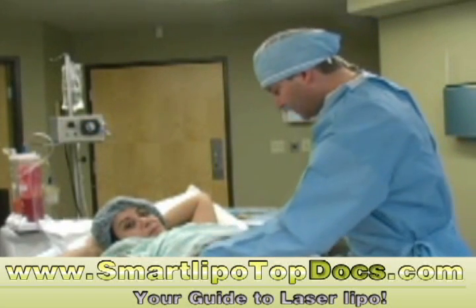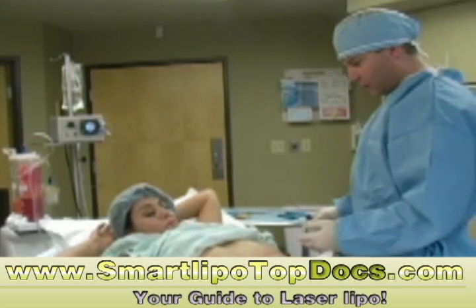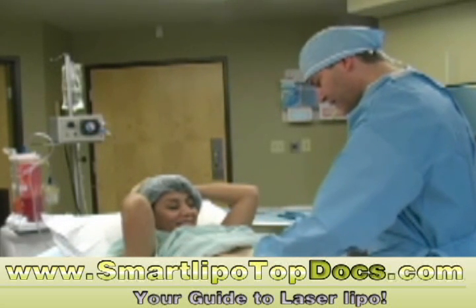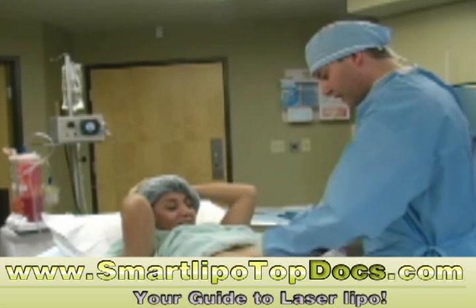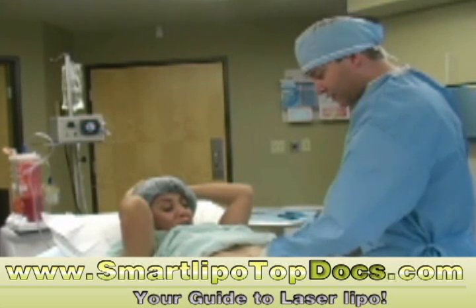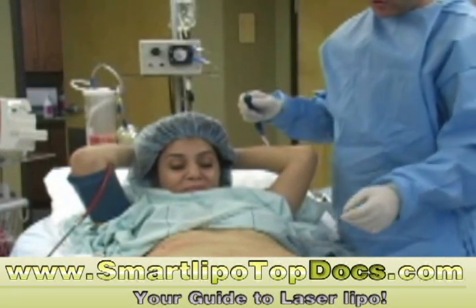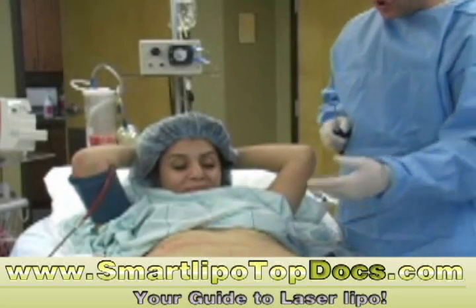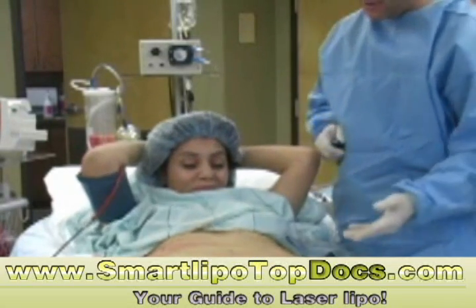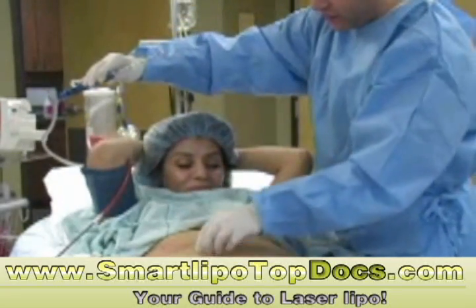Now we're in the final stages. I just want to make sure that we have everything perfect. I want you to tighten your abdominal muscles for me, almost like you're doing a little crunch. That really allows me to check to make sure that we got things the way we wanted. It's a little difficult for you to tell because you're very swollen right now with fluid. But I can tell — as you can see, we're left with about a quarter inch of fat; we started off with about three and a half inches. This is one of the tremendous advantages of doing this procedure under local anesthesia. Because you're awake and able to cooperate, you can see how it pushes some of that deep fat up to me that I would have never seen before. So I can get a much more thorough removal of your fat compartment while you do that. Okay, you can lay down again.